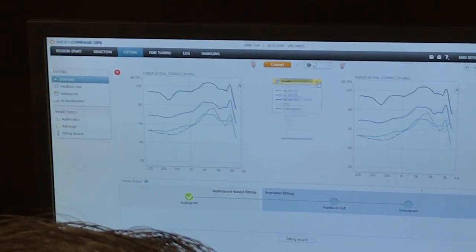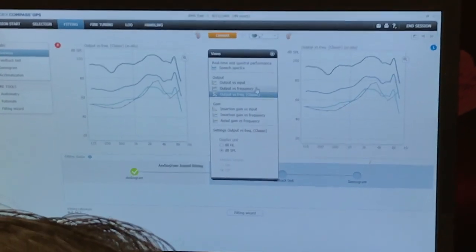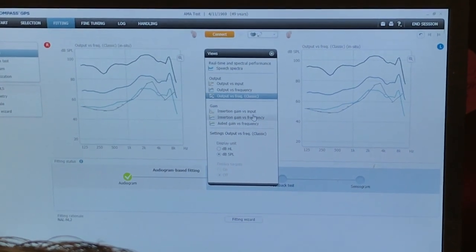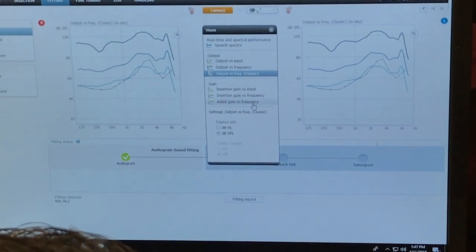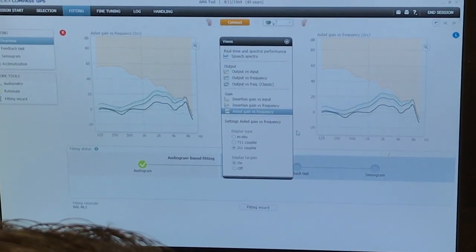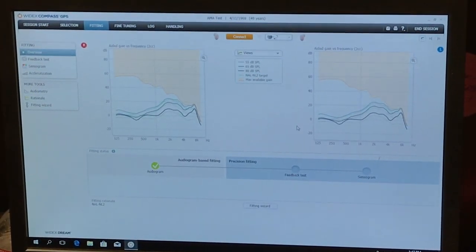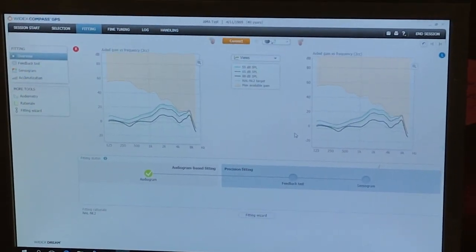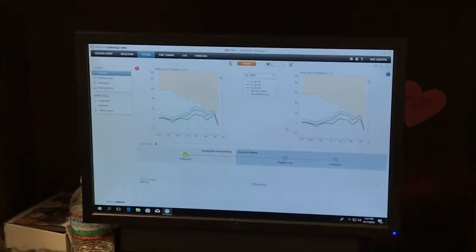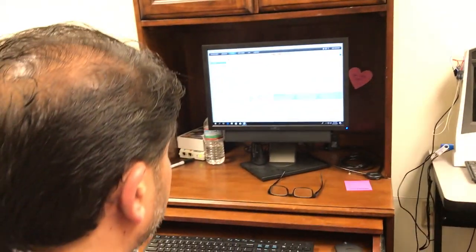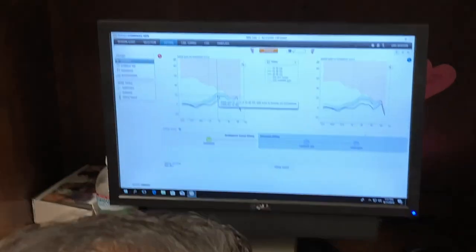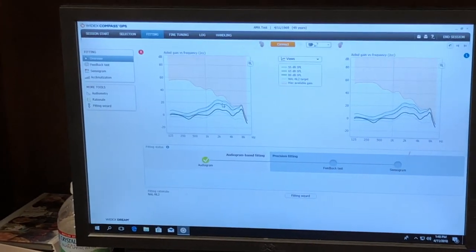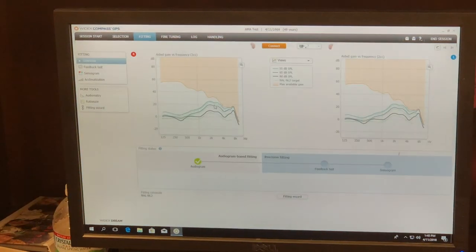If I change this to gain versus frequency, aided gain versus frequency, this is what I get. This is the amount of gain that I'm going to get. And when you do your real ear, your REAG, that's what you're going to look at. So this device resonates at about 1800 hertz, which is why you do the real ear unaided gain.